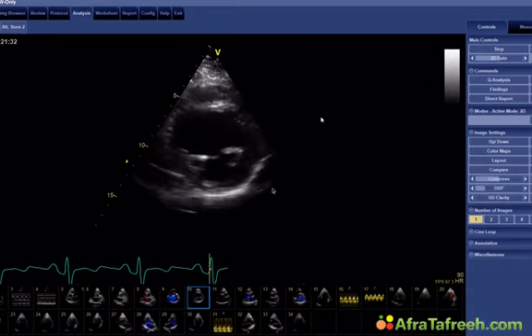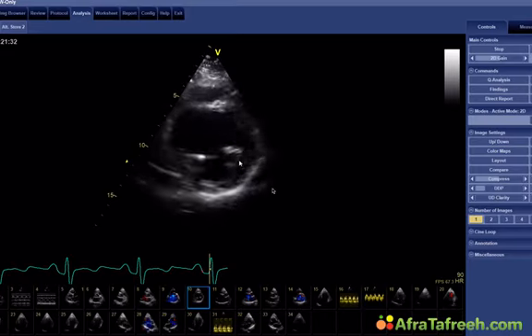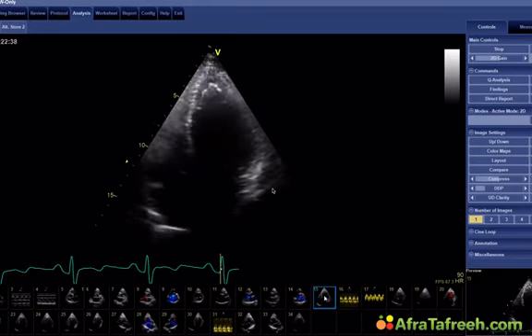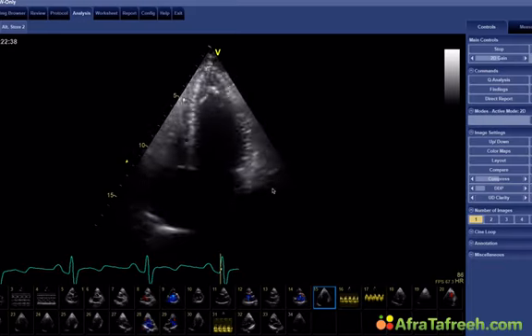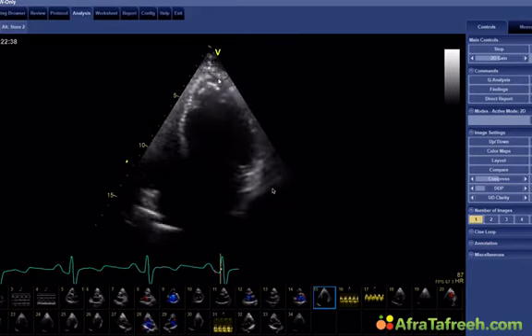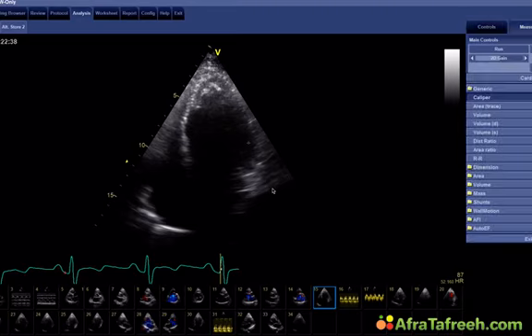Okay, let me show you the short axis view. See, we have very good left ventricular function. There's nothing wrong with the ventricle here. Again, the hypereosinophilic infiltrate right here at the apex, this will not vanish. In the initial phase, it did get a little smaller, but I guess this is so fibrotic that even if the eosinophilic cells are now normal, this will not vanish. But the ventricle seems to be smaller. Let's measure this. Yeah, as a matter of fact, it is. It's 49. We had 52, maybe 53 before, so it is smaller.